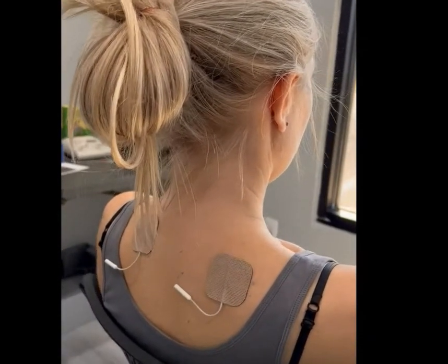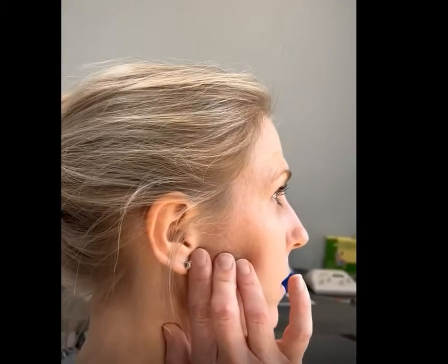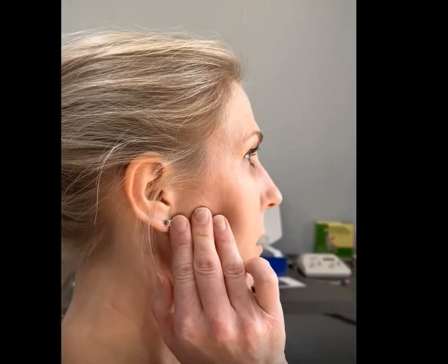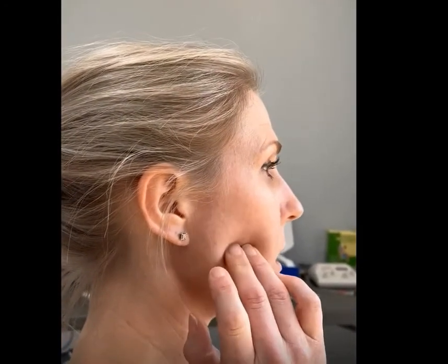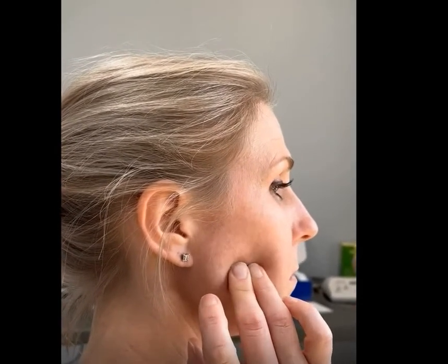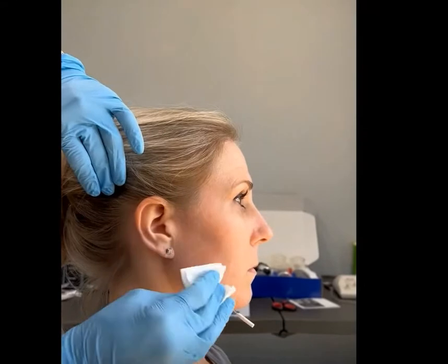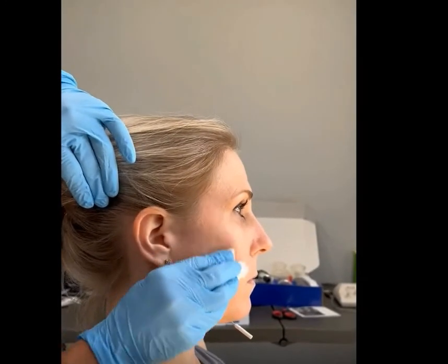Next, identify the trigger point in the masseter muscle. This is done by biting your back teeth together and feeling where the muscle bulges in the front of the earlobe and below your zygoma bone. Normally this is about a three-finger width in front of your lower earlobe. Remember, it is very important that this pad is placed below the bone on the muscle and not on the bone.